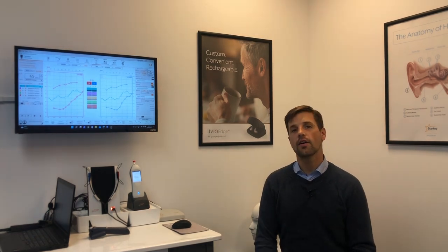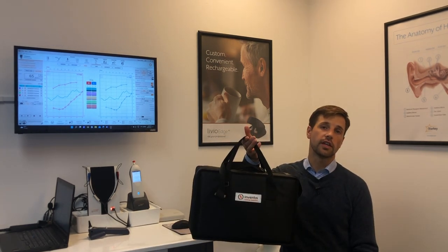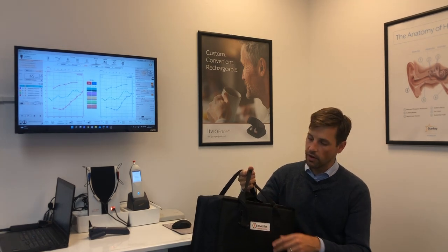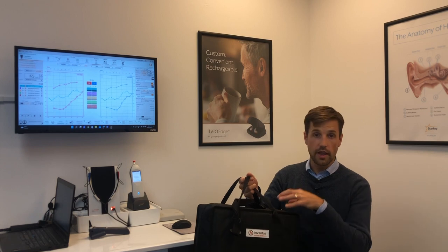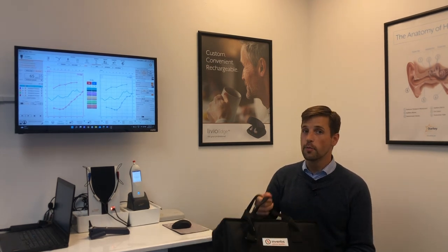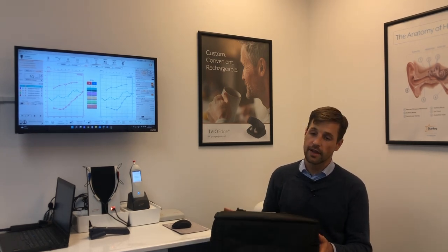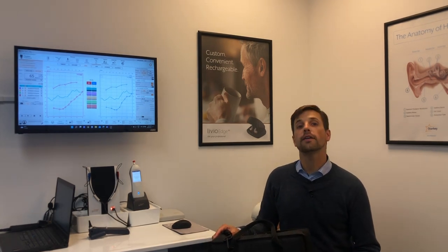I can pack up this entire office into this single carrying case — the Trumpet, the Piccolo audiometer, the tympanometer, and the otoscope, which are all very small. If I'm really careful I can even get the laptop in the same bag, it does actually fit, but most of the time I just take a separate bag for that. Two bags ain't bad.